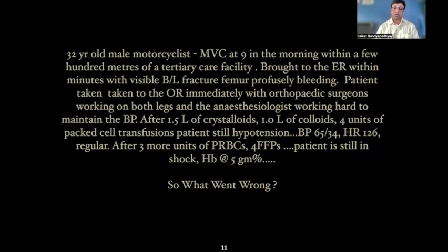Another patient, although this is not a cardiac surgical patient, just to give an example of how POCUS is very useful. This is a 32-year-old male motorcyclist.